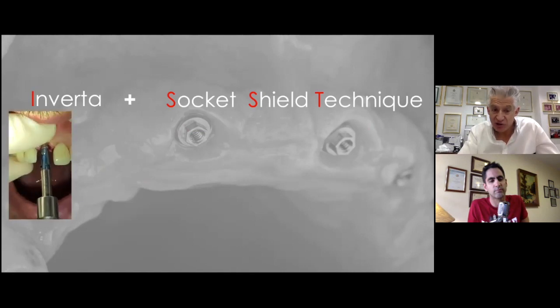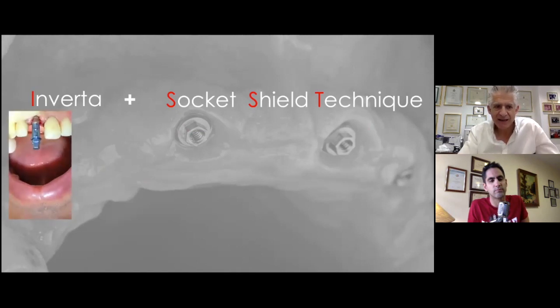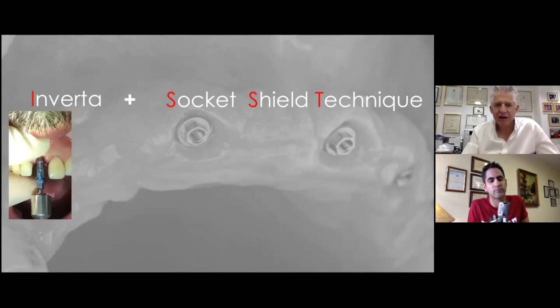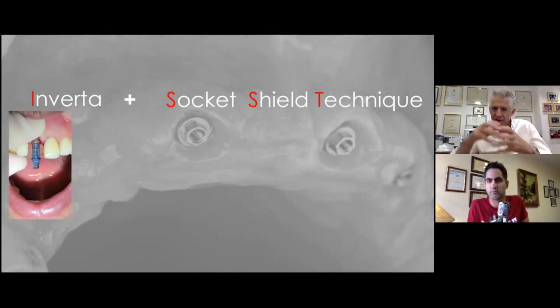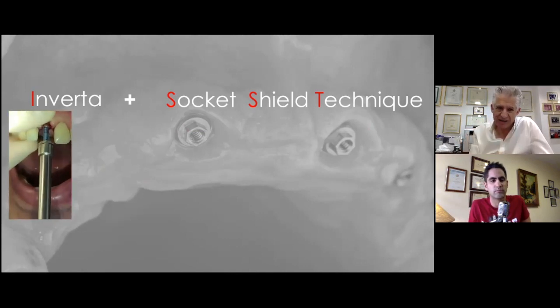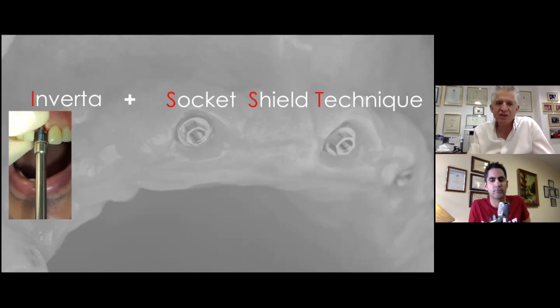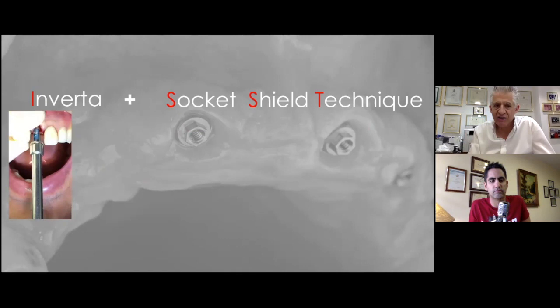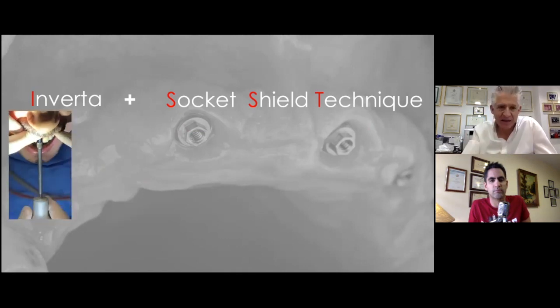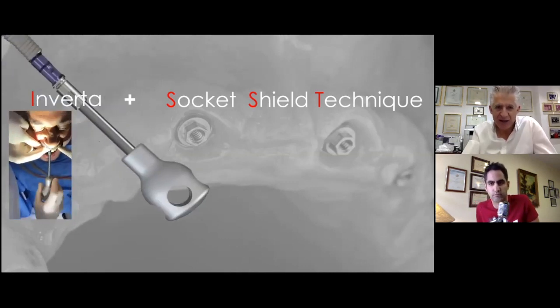I'm starting to generate high primary stability here now. And I need to tighten the fixture mount. Otherwise, the fixture mount can come loose. It's always good to tighten these fixture mounts more to about 45 Newton centimeter if you are achieving high primary stability. And what I'm using here is a zygomatic implant inserter to place my implant.